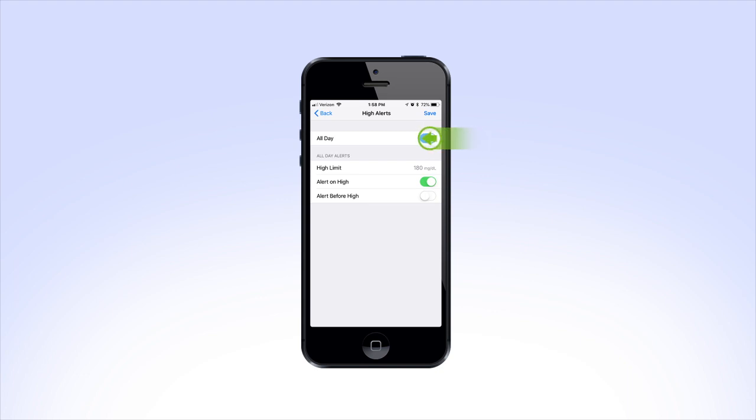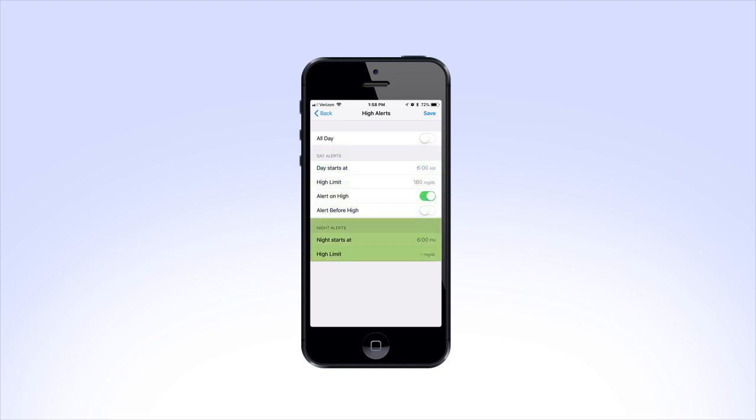You can also turn off the All Day feature so you have the option to program two sets of alerts for daytime and nighttime instead. If you choose to have two limits set, you'll see you now have two sections to complete: Day Alerts and Night Alerts.